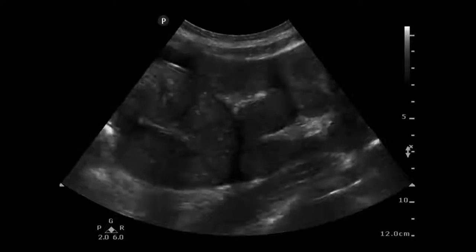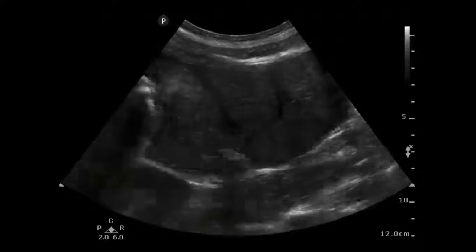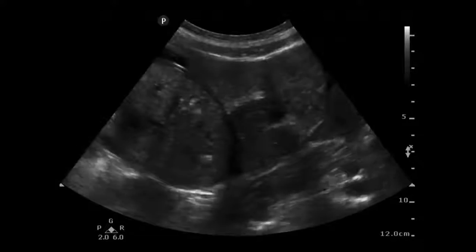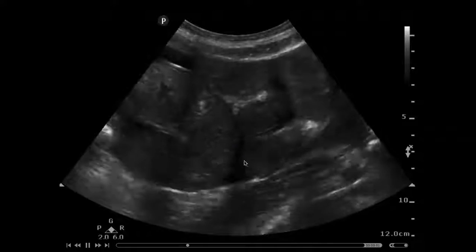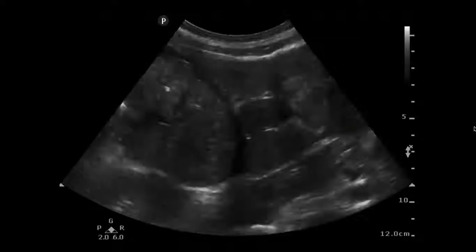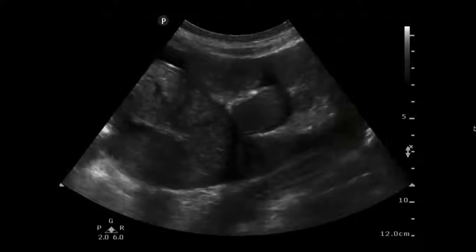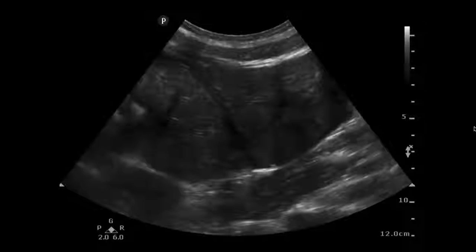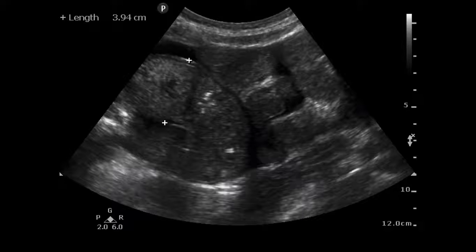This is what abnormal looks like. We can see multiple loops of dilated small bowel, and if we look up here and down here, we can see a little bit of abdominal free fluid, which indicates a poor prognosis. When we actually measure this out, it measures 3.9 centimeters, which is above our cutoff of 2.5.